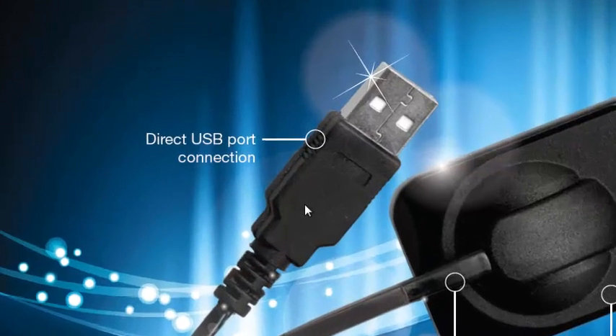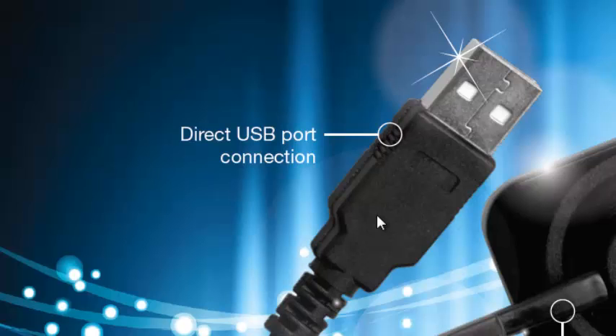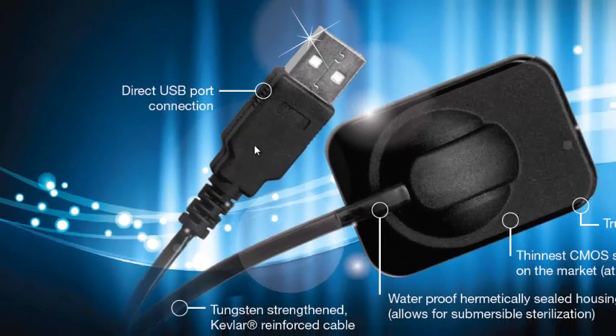First of all, the sensor plugs directly into your computer. It's a CMOS sensor using the latest technology, and it's a direct connect — no USB box necessary. It plugs right into your computer.